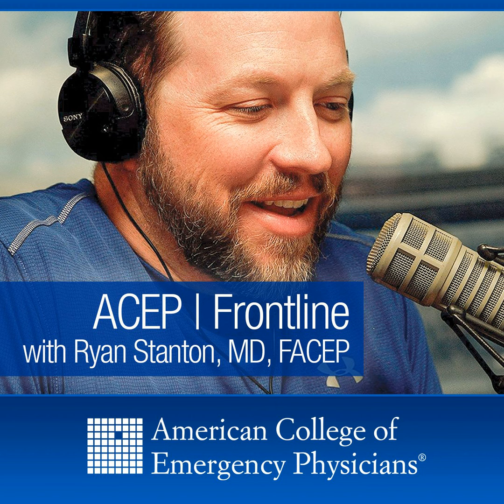So what am I looking for? Specifically, we're looking for, as we said already, the location of your LV, and you don't necessarily need ultrasound for this, but appropriate depth, speed, and compression of the LV with full recoil to promote forward flow of your circulation. So really, you're looking specifically at the LV for compression location and compression adequacy. In addition to the etiologies like effusion or tamponade, RV size for PE, and so on.